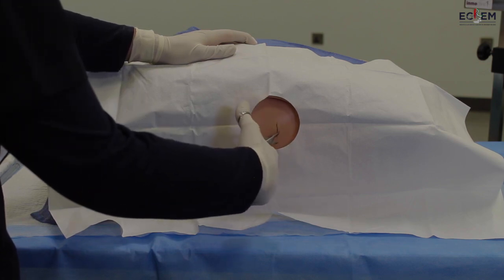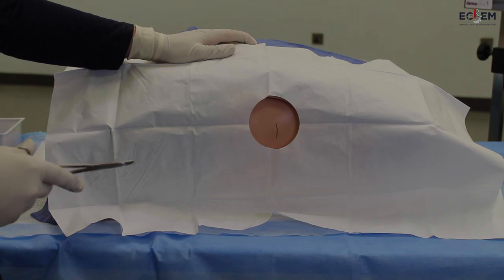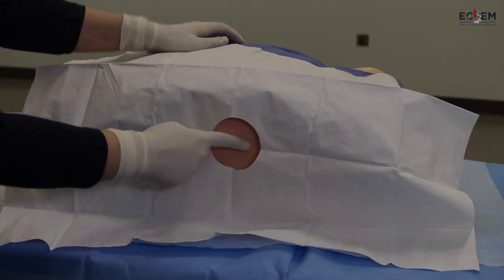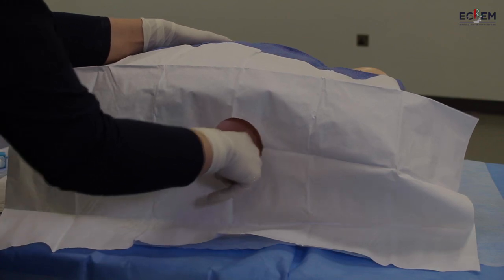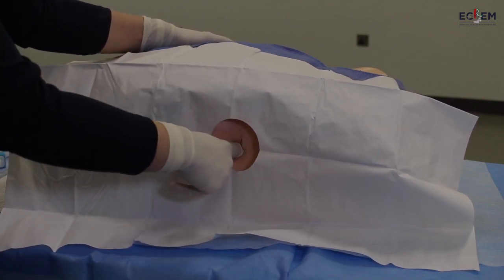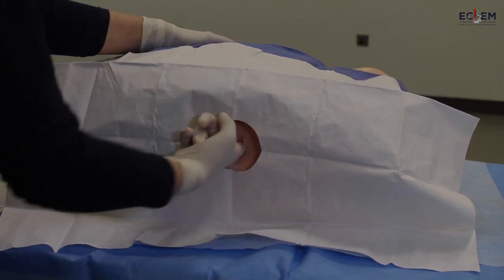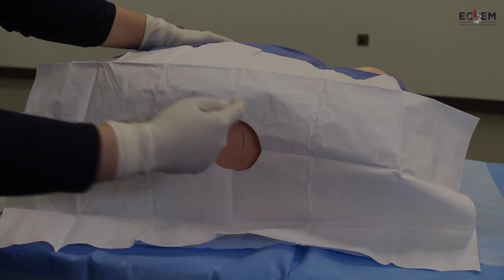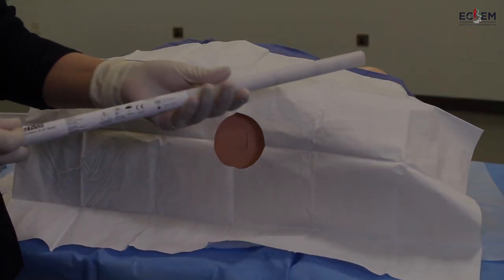With a sterile finger, go inside the incision into the tract we made and feel for any adhesions, feel for the lung, for the pleural space — get an idea of where your tract is — then take it out. For the chest tube we're using a 32 French.